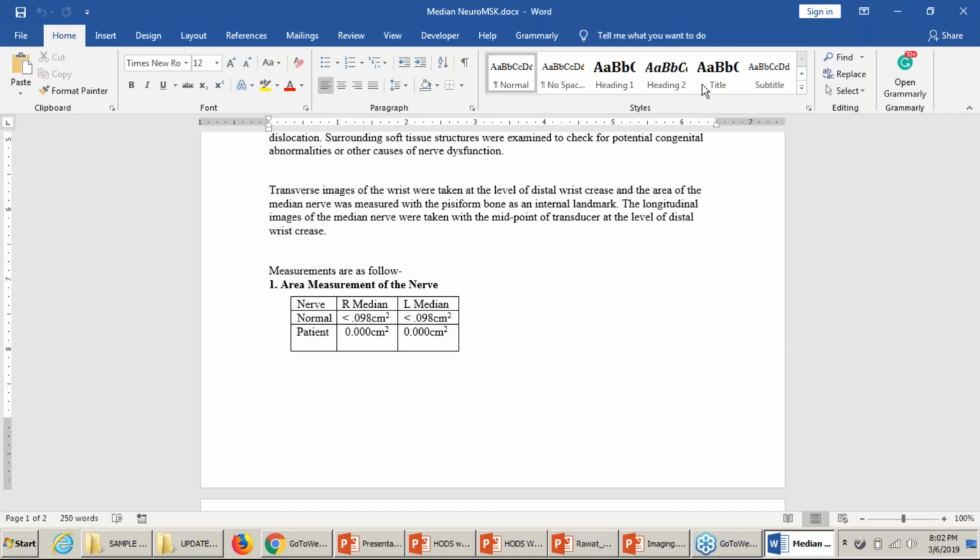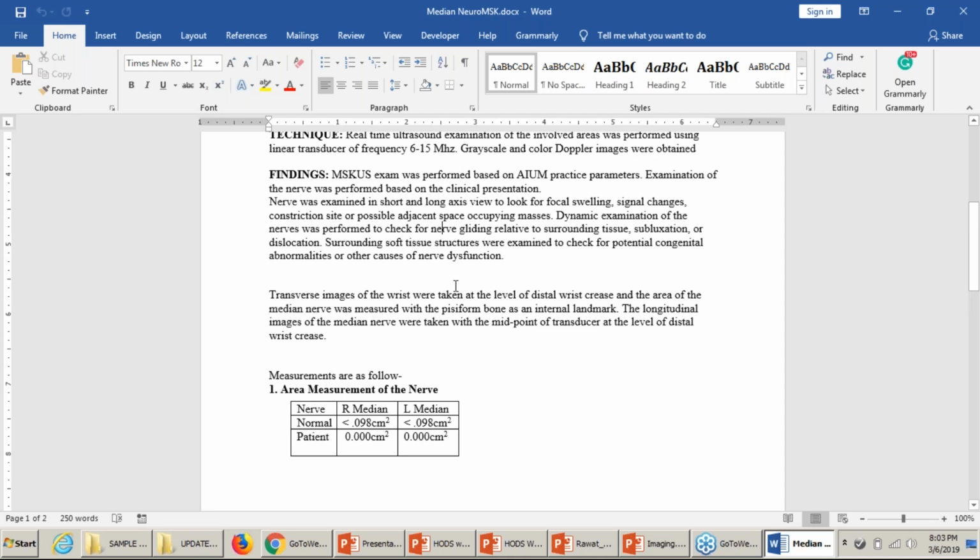I'm going to just look at some questions because I think some people typed some questions. Okay, so Bill is asking, we no longer refer to LAX and SAX. Yeah, short axis view and long axis view is SAX and LAX. Or you can say short axis and long axis, as you can see here. I think you're probably referring to the previous finding in the previous template.